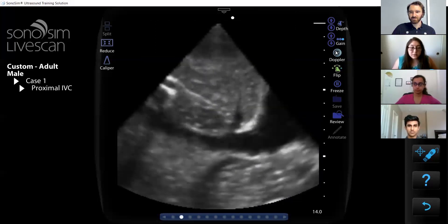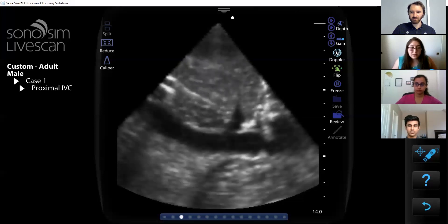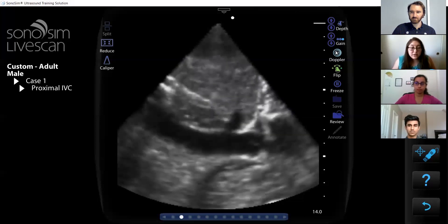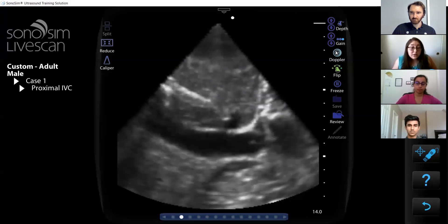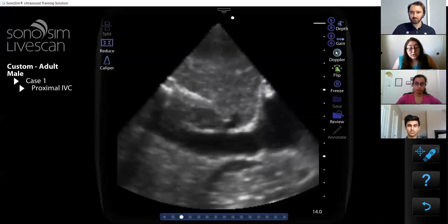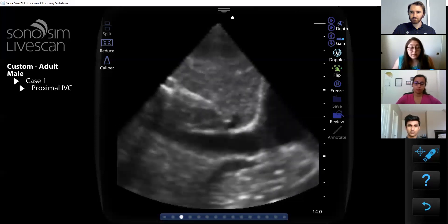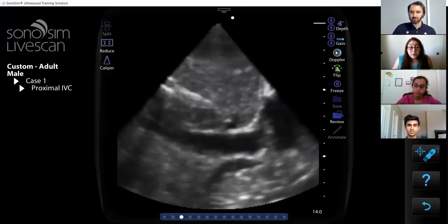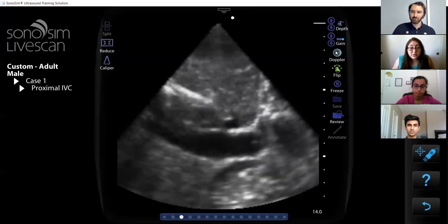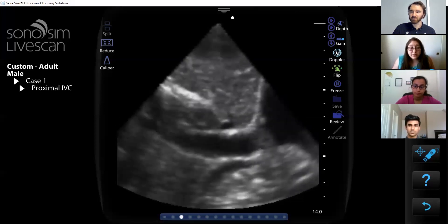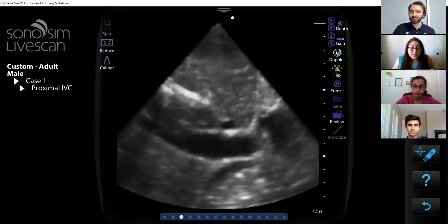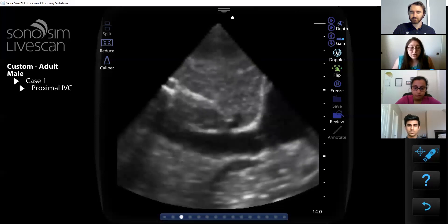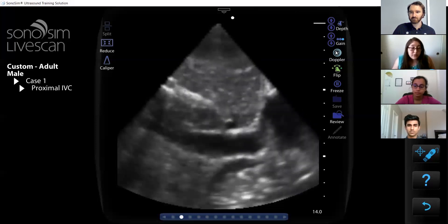Based on what you've seen, what are you thinking this might be? Well, in the context of an elderly nursing home patient presenting with fevers and cough, it could be consistent with diffuse alveolar interstitial syndrome, which could also be suggestive of widespread involvement of both lungs due to COVID-19 infection. Alternatively, another viral pneumonia could be the explanation. It could be CHF or pulmonary fibrosis, but based on the clinical context and the normal limited echo findings, it's less supportive of those etiologies.